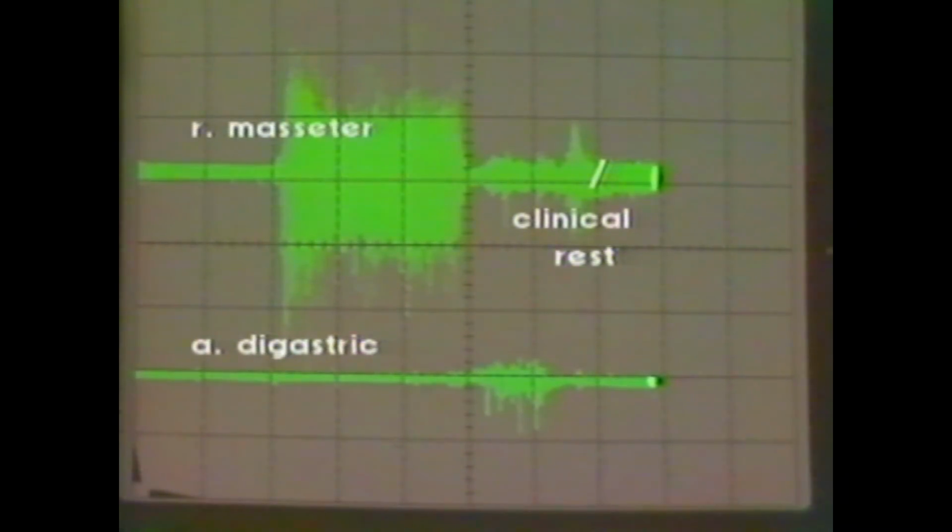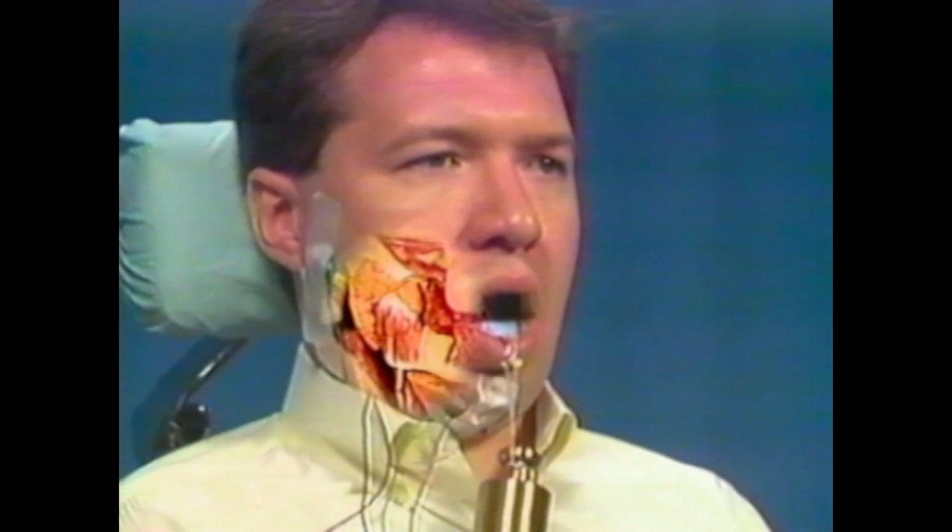There is an increase in motor unit recruitment in the clinical rest position. Therefore, the subject will relax the masticatory muscles and allow the mandible to open to a position where minimal electrical activity occurs. The subject has subconsciously reduced motor unit activity to the masseter and stabilizes the loaded jaw by using the non-contractile fascia, tendons, and ligaments to support the jaw in this position. This action reduces the energy required for the masseter muscles to support this weight.